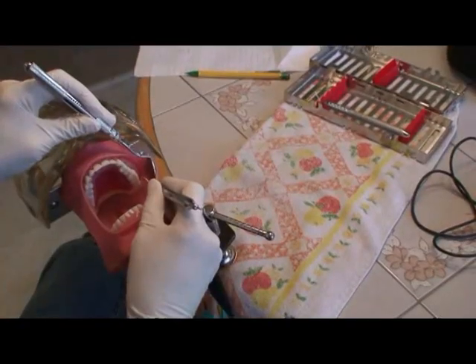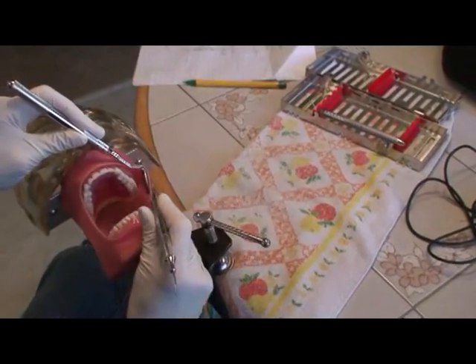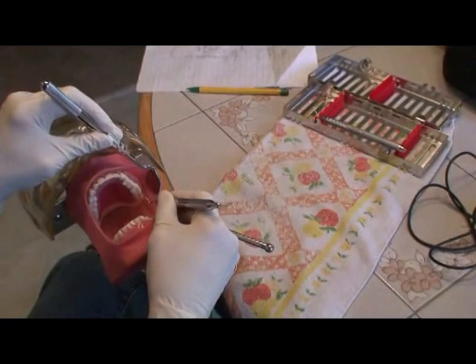And the upper left facial, extraoral fulcrum, cup the chin. Bring the hand to the side and then start at the distalmost tooth.